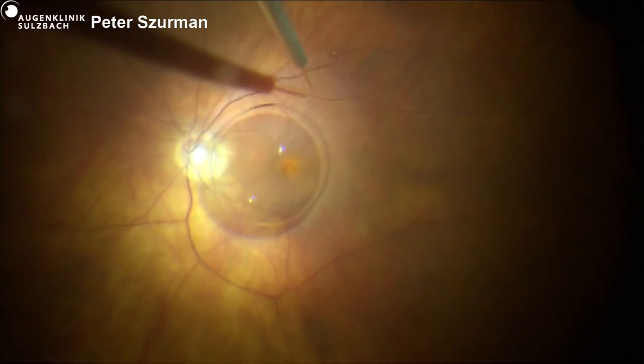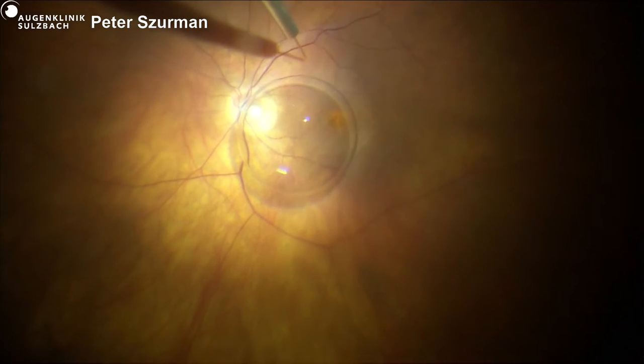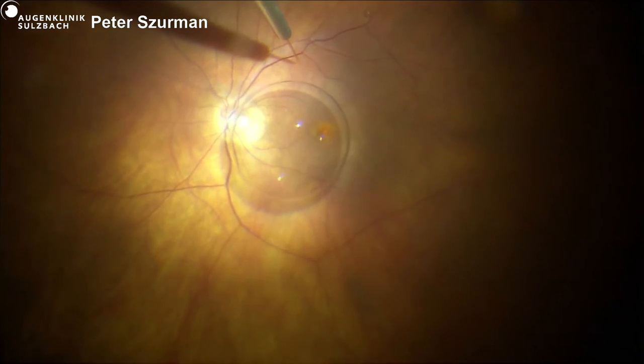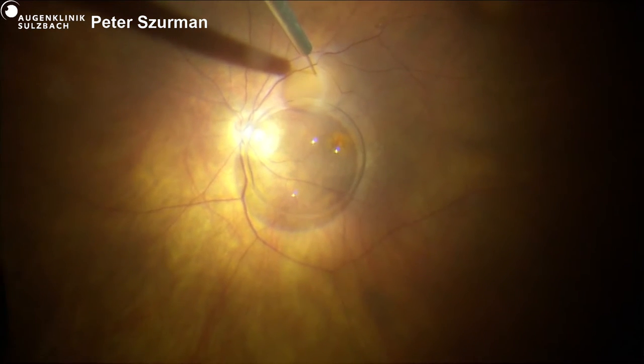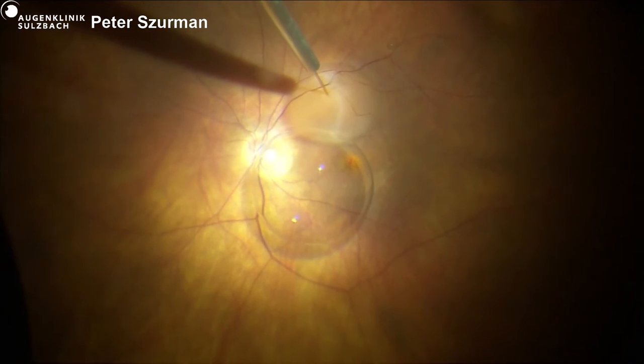Okay, jetzt langsam spüren. Go. How is the injection done? Manually? Very good question. It's still done manually.